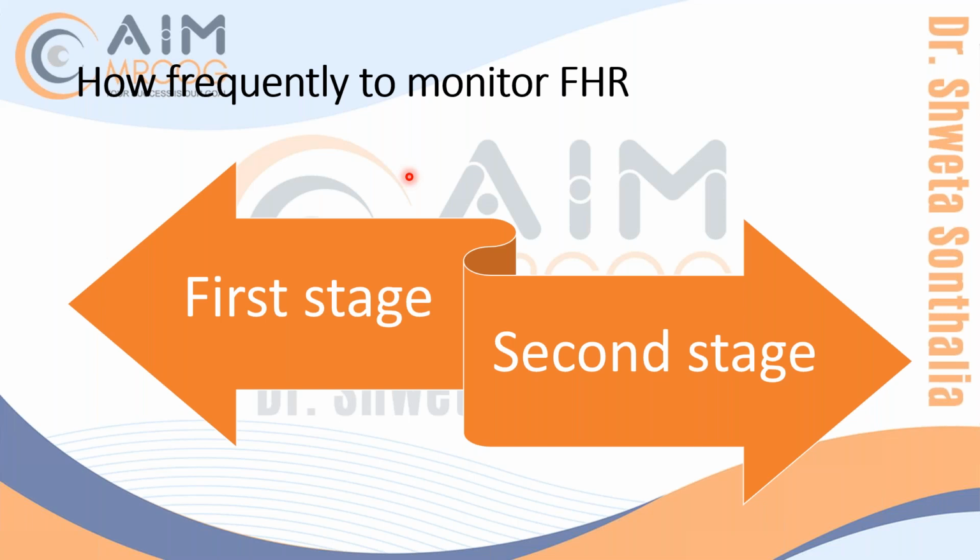The most important aspect of CTG is variability. It's not the decelerations which are concerning. It's mainly the variability of the CTG which tells you how good the baby is. Variability is the last thing to go, and once it is gone, you are dealing with a bad baby, a baby who is hypoxic. So in the exam, it's very, very important that when you read the CTG you look at variability, because it tells you how significant and how bad the decelerations are. If you have good variability and accelerations with the decelerations, you don't worry much.